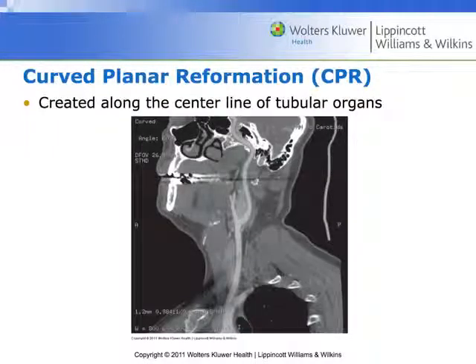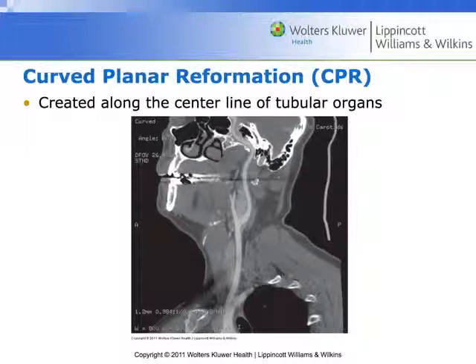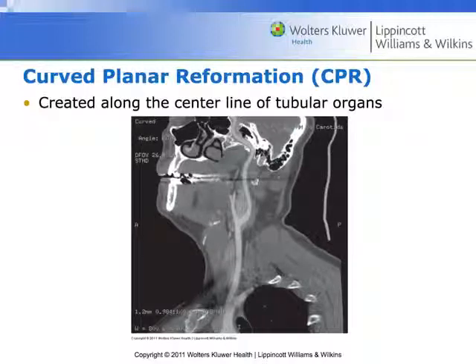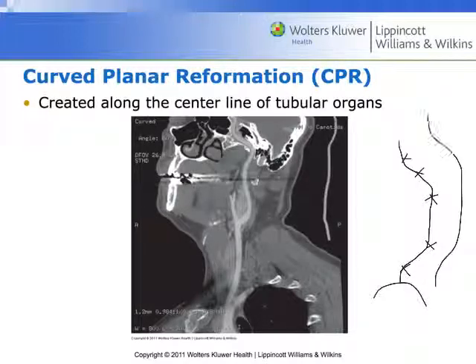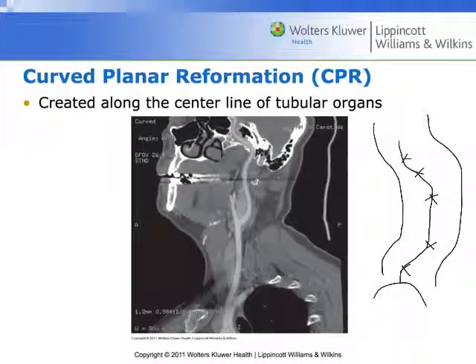Curved planar reformats are created along the center line of a tubular organ, and techs are manually putting in waypoints for the machine to create a curvilinear image format plane. Here's an example of the entire carotid artery — more or less from the arch of the aorta up into the brain — done in a curved planar reformat. They've put waypoints along the length of the carotid artery to tell the machine exactly how it should be reformatting, creating a plane of reformatting that follows the vessel, so as it slices through the anatomy, we get a single slice with the entire carotid artery on it.